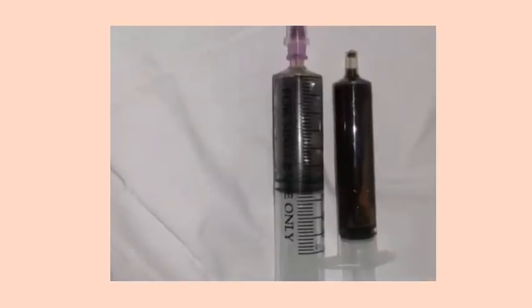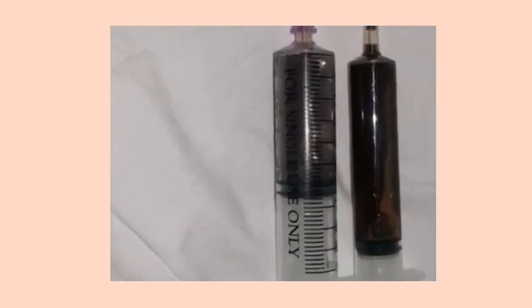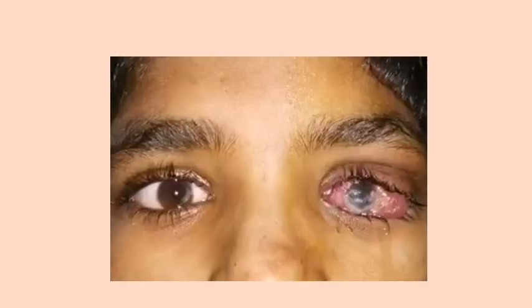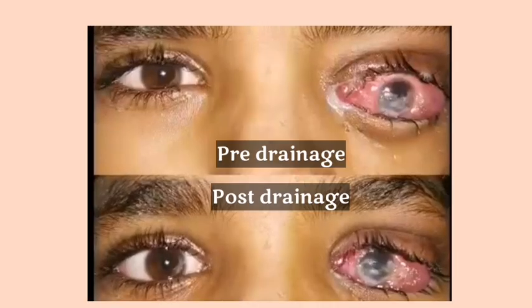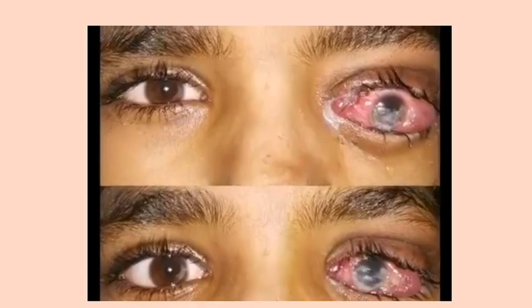We were able to aspirate roughly 15 milliliters of blood, and immediately after the aspiration there was reduction in the ptosis. Here are the pre and post drainage photographs.